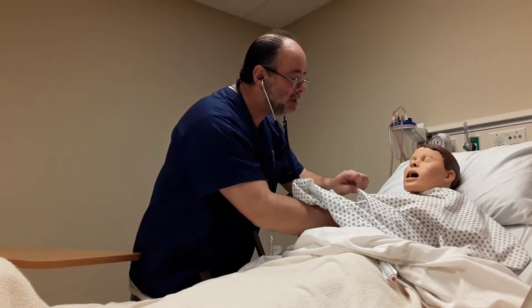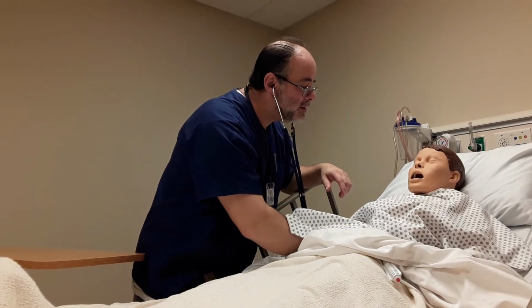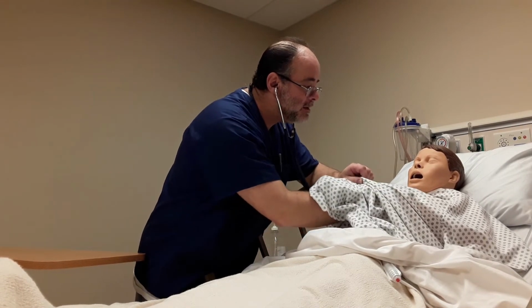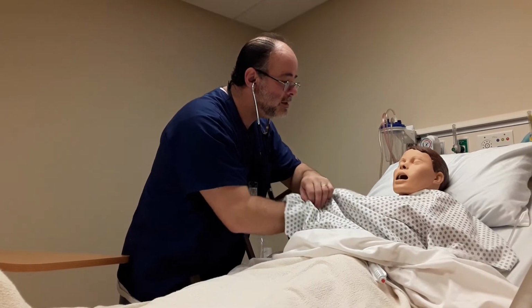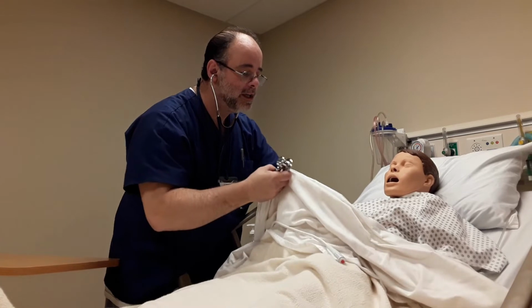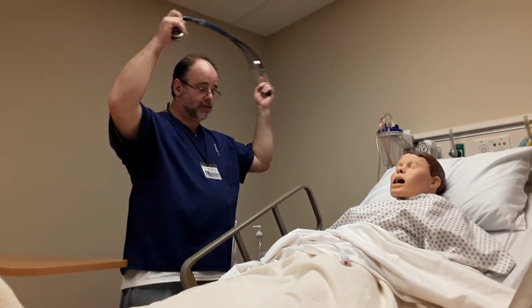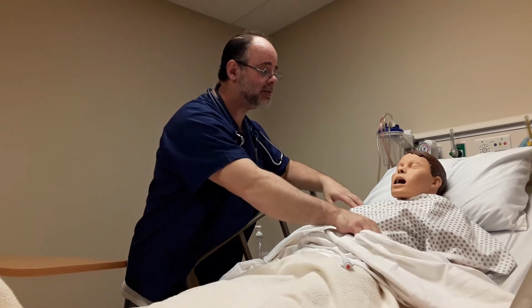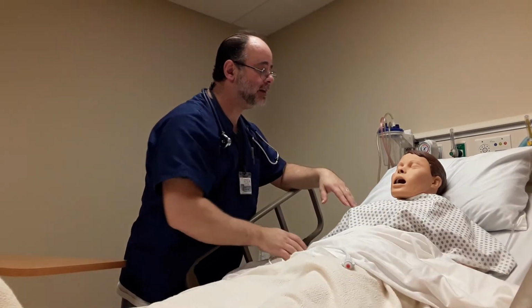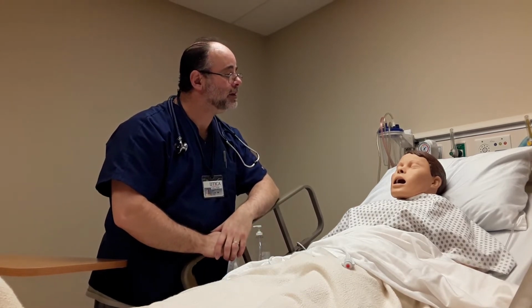Lung sounds, sir, I'm going to listen to your lung sounds now. Take a deep breath in and out, deep breath in and out. Okay, lung sounds are good. Purpose of listening to lung sounds for this procedure is to know what you have for sounds prior to procedure, just in case there's any concern later on if you place the tube down into the bronchial area.